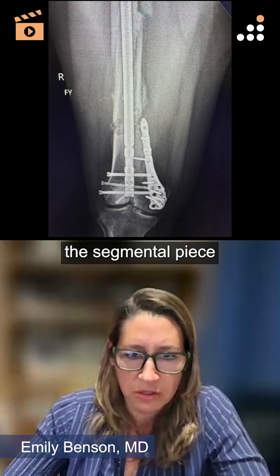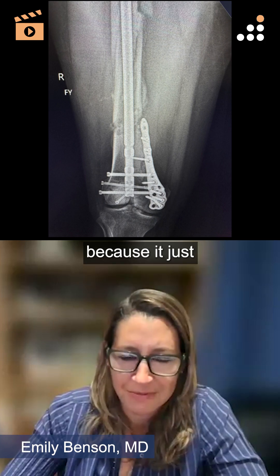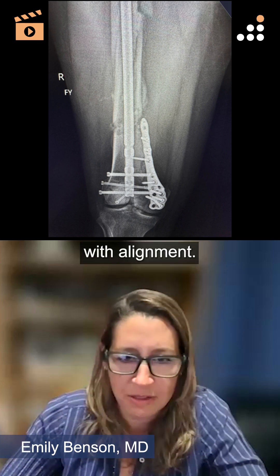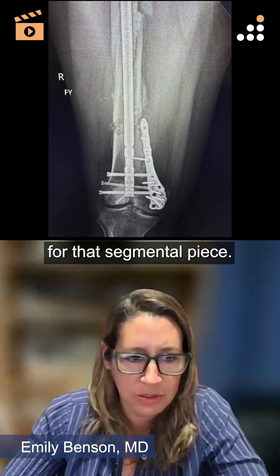This plate did kind of push the segmental piece back into a little bit better reduction because it just barely touches it on the medial side and it assisted with alignment, but that was all it did for that segmental piece.